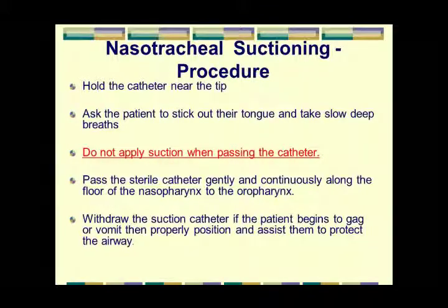Go ahead and insert the catheter into the nasopharynx through the nasopharyngeal tube, or in the tracheal tube as the case may be. And we're going to insert it having the patient, if it's nasopharyngeal area, you can facilitate getting into the trachea by having them stick their tongue out. Okay. I'm inserting it without vacuum. The catheter moves far easier if it's not applying vacuum at the time. Think about it logically. Okay. You can pass it through.